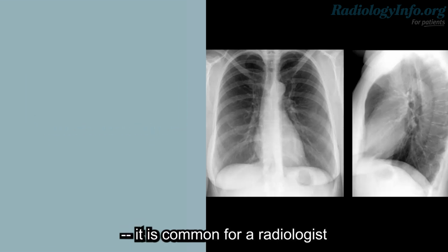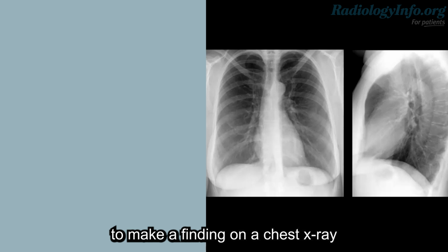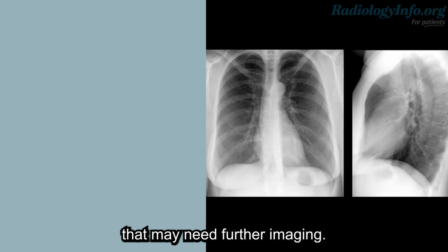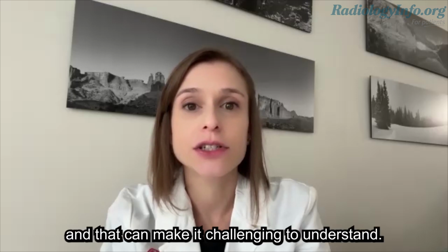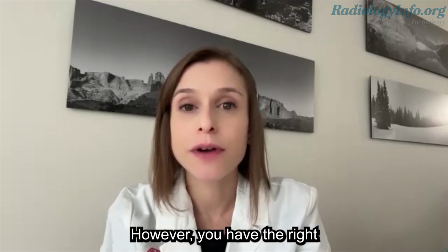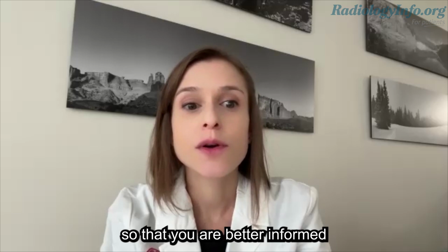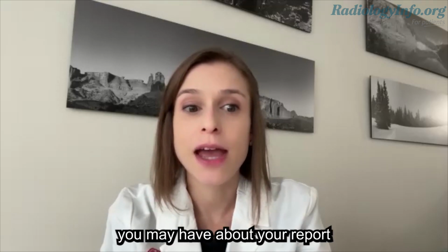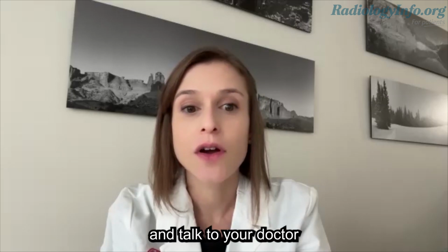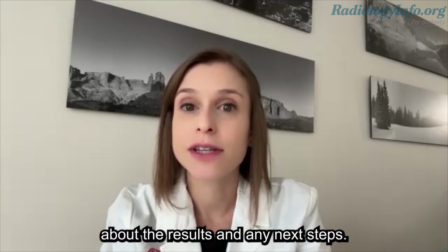Keep in mind it is common for a radiologist to make a finding on a chest x-ray that may need further imaging. Remember, your radiology report is written for your healthcare provider, and that can make it challenging to understand. However, you have the right to see your radiology report so that you are better informed about your body and health. Write down any questions or concerns you may have about your report and talk to your doctor or healthcare provider about the results and any next steps.